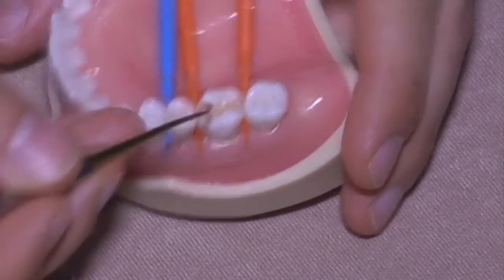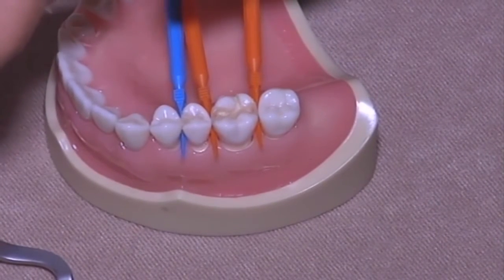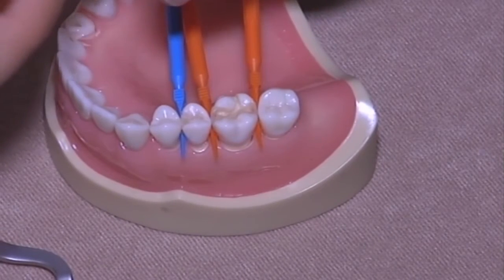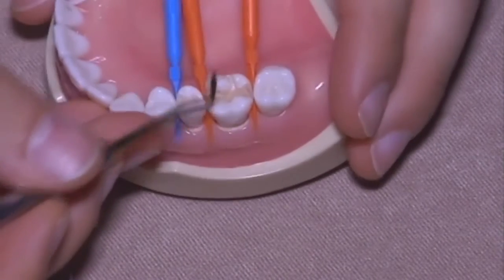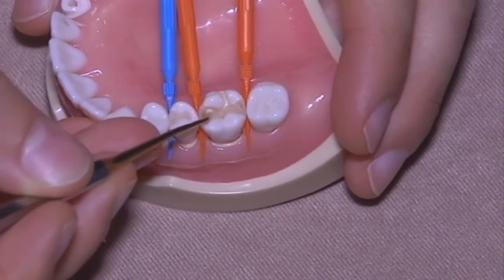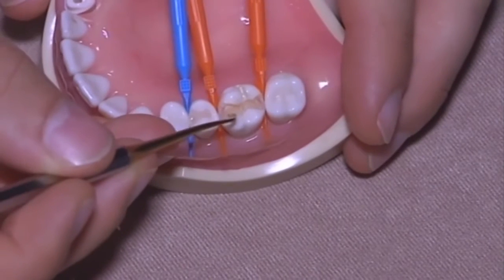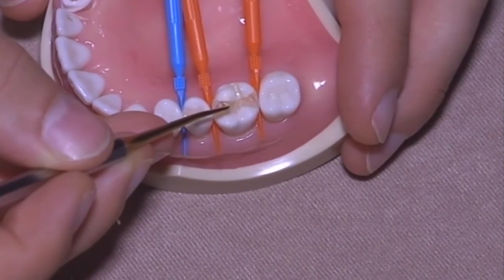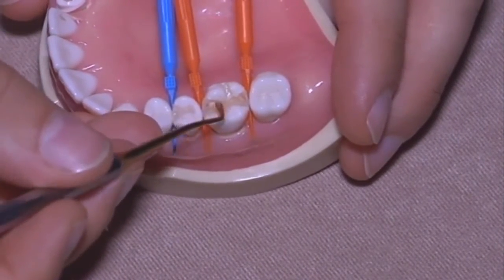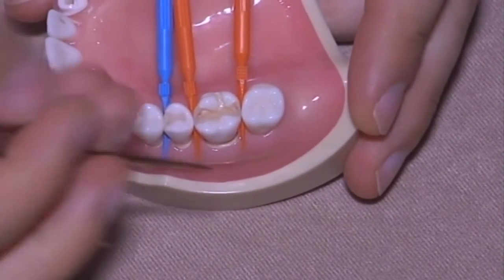The other attention you have to pay is to have the composite touching one wall only. If the composite touches the opposite wall, you are not solving or limiting the problem of contraction stress on the posteriors.